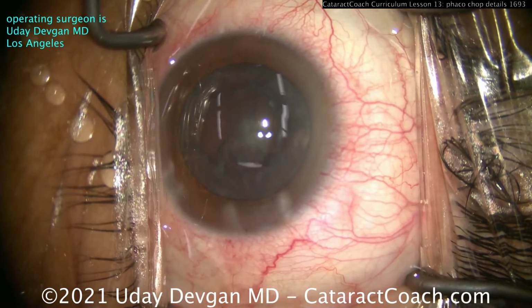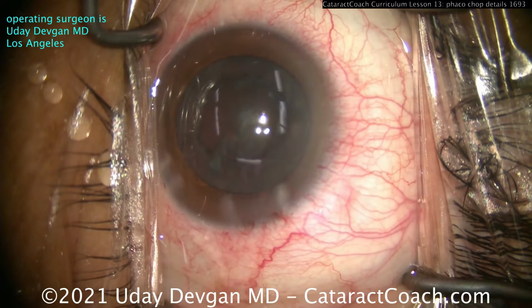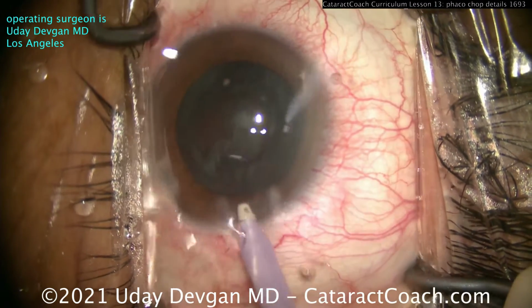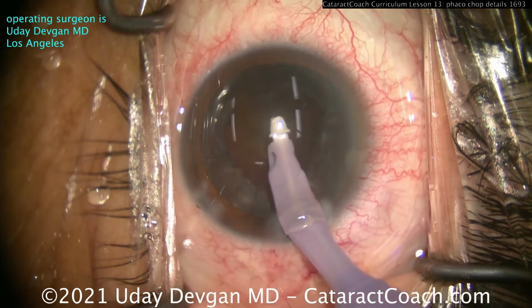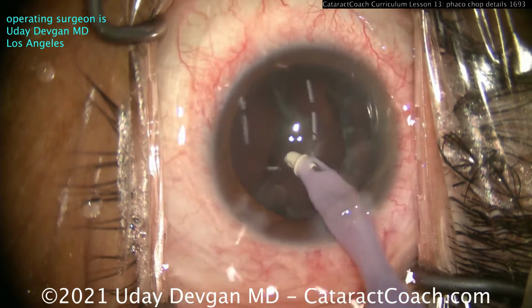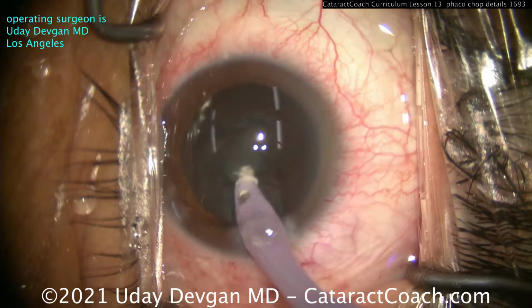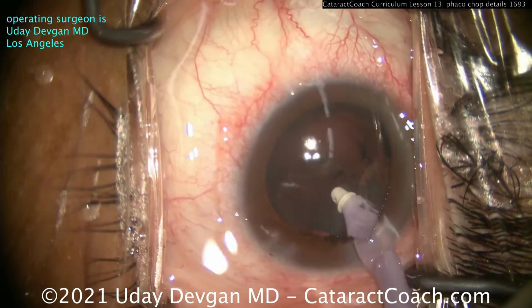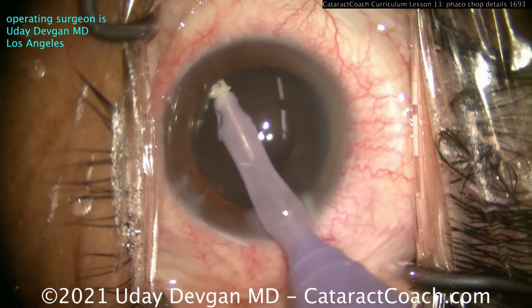Now, in this case, it's soft enough. Let's not be crazy with the phaco probe. Let's switch to the IA probe, because the IA probe has that soft polymer tip that's far more gentle on the posterior capsule. Remember, you're a professional. You're in private practice with a very fancy clinic here. You cannot risk a broken or ruptured posterior capsule. That should be a very, very rare event for you. Maybe 1 in 1,000. So we have to be very cautious and stay away from the capsule.